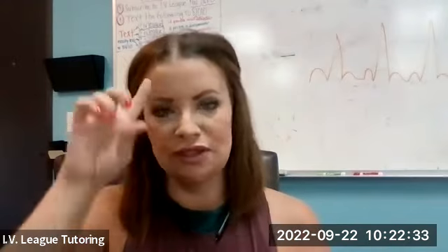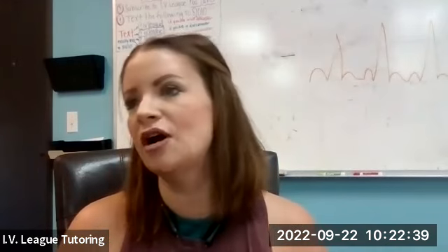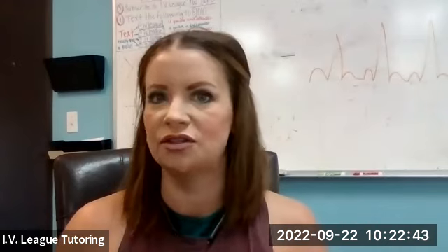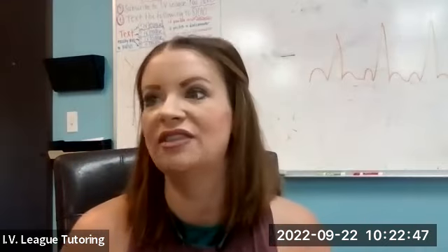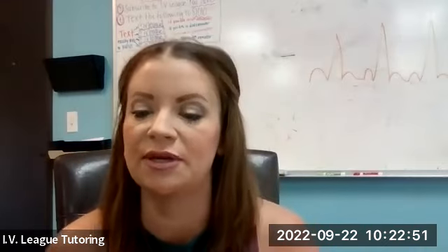Okay. So that's something that you're going to have to do on an exam, and obviously you're going to have to do it in person, because determining the heart rate makes things easier. It's kind of like doing your ABGs: you do the pH first, and you already know if it's acidosis or alkalosis. So the first thing you're going to do is look at that. Then that can already tell you whether they're tachy or Brady, and then you can figure it out from there. Does that make sense?